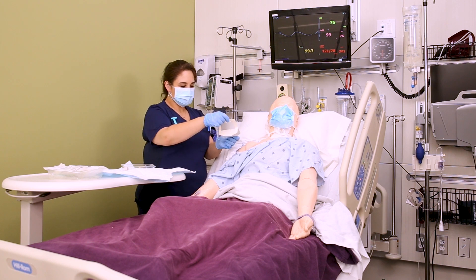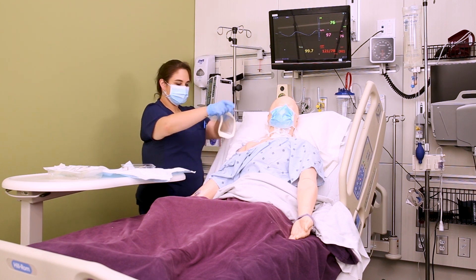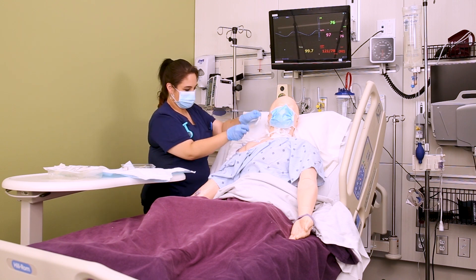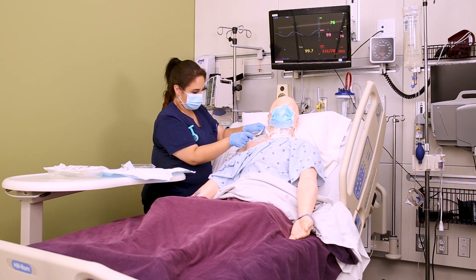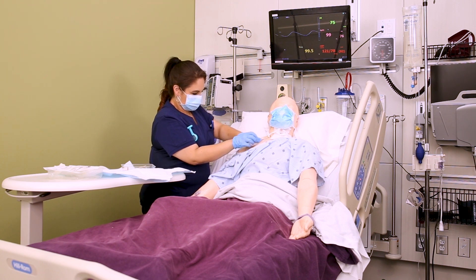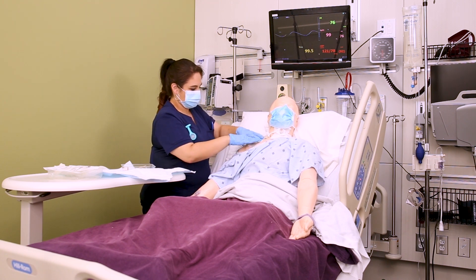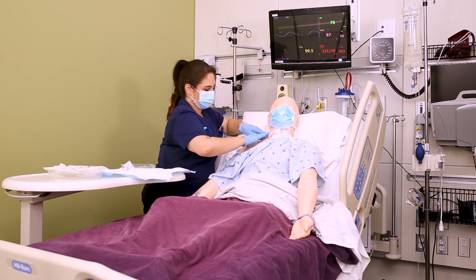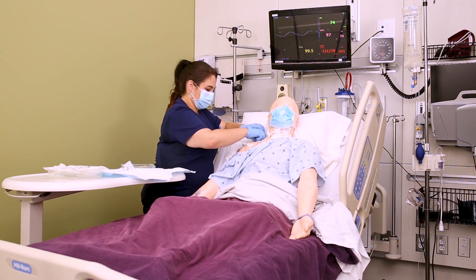Now apply your dressing. Tegaderm dressings are activated with heat and friction, so once you apply it over the site, give it a little press and rub to make sure it sticks. Some larger dressings include an extra piece of tape that you can use to help secure your line.